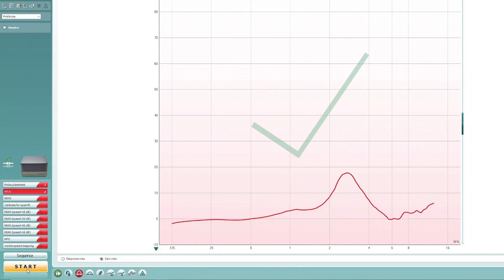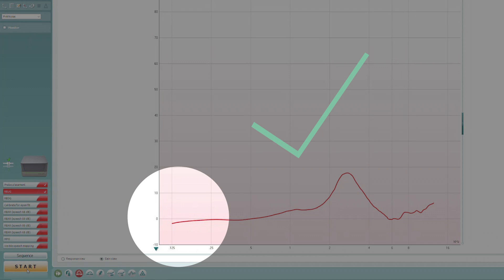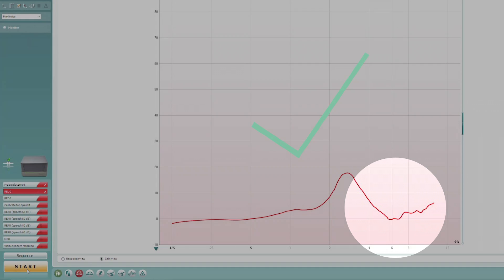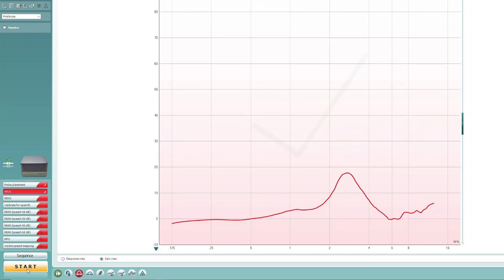A correct probe tube placement will result in an REUG measurement that starts at 0 decibels in the low frequencies, dips down between 4 to 8 kilohertz, and then recovers. The curve should be mostly positive throughout.